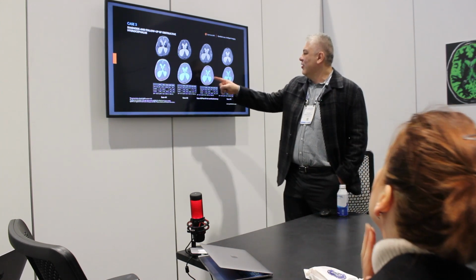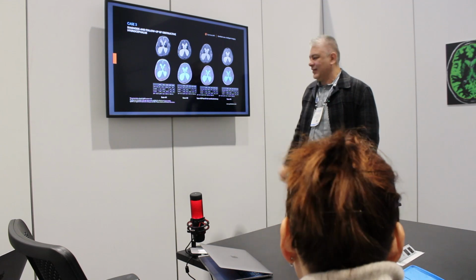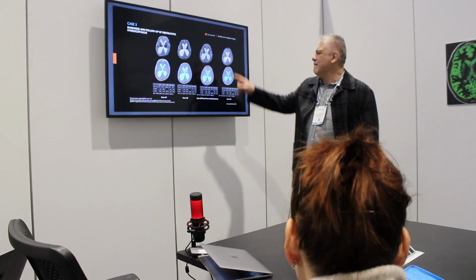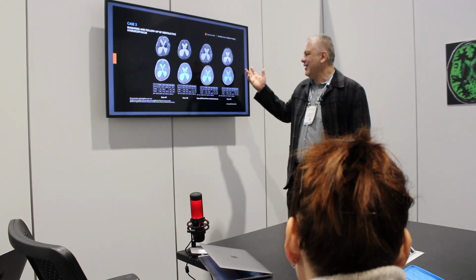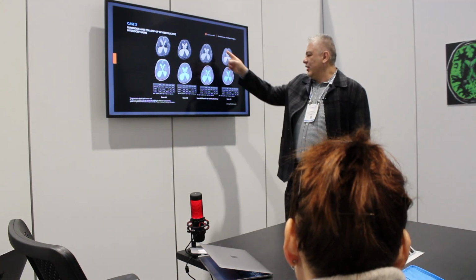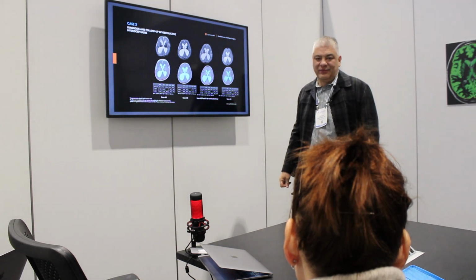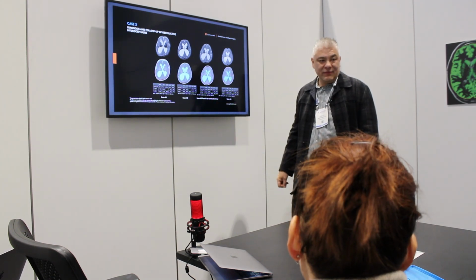Like if you try to measure like this, these look quite similar, honestly. Like if you just look at the images, they look very similar. Maybe this is a little smaller, but it's not really. But now you can see, yeah, it's 100 milliliters less. So it's not a little, it's significant. So you can express it in numbers.